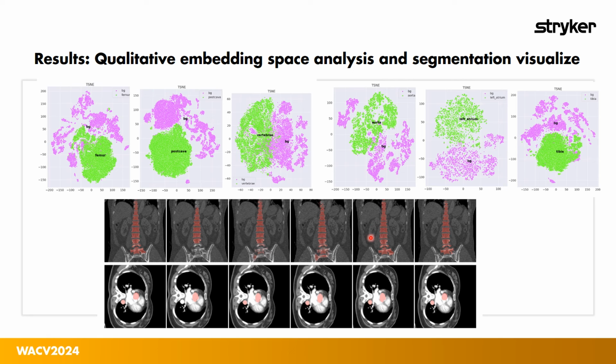Keep in mind that when we mention the box prompts, these boxes are derived from the ground truth segmentation, so it's not really realistic in real-world applications, where the user has to give a very accurate box. You always introduce human errors. Here you already see that the proposed approach with 50 images achieves a pretty good result when compared with the UNet and SAM with box prompts.